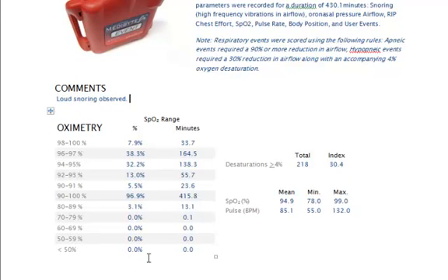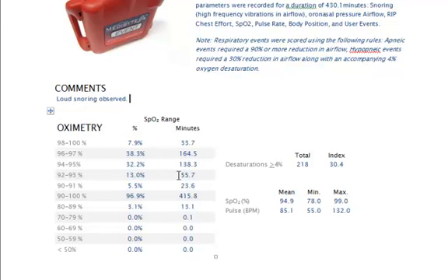This is a breakdown of the pulse oximetry table. Between 90 and 100%, it is also broken down in 2% increments, which gives you more sensitivity to look at the mild cases. Anything less than 50% is generally considered to be poor quality.